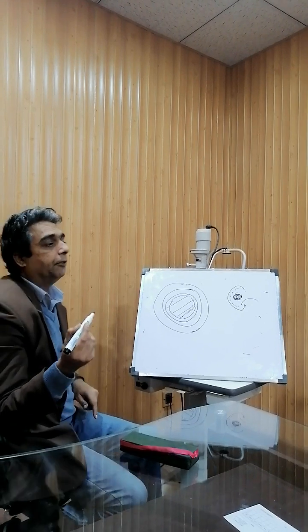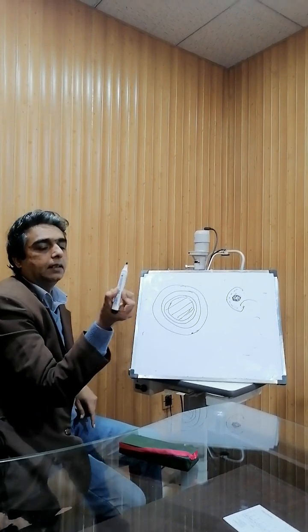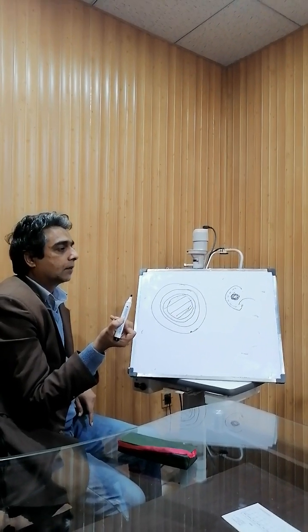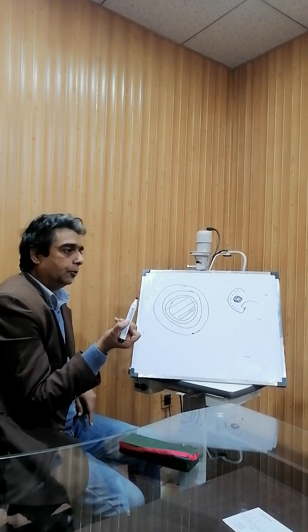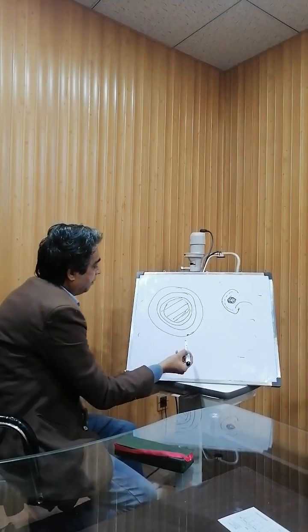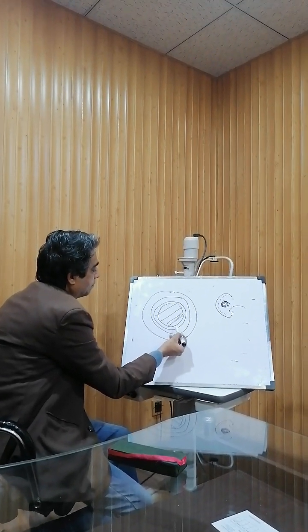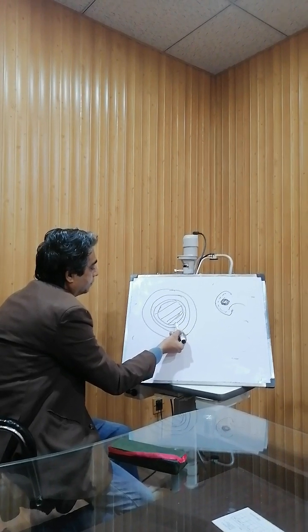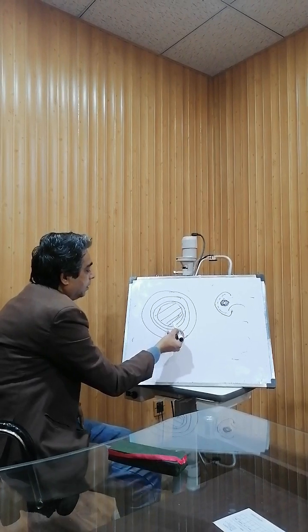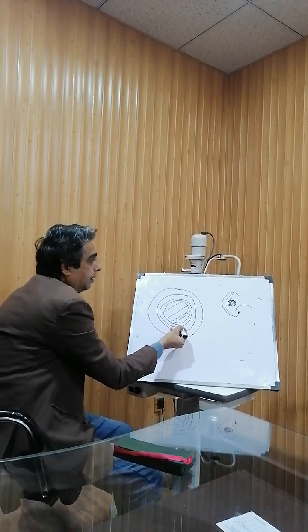Now we will enter the phaco probe, which is like a pen, and we have a control in our foot. After putting the gel, we will put this probe over the nucleus, and we will push the foot pedal.